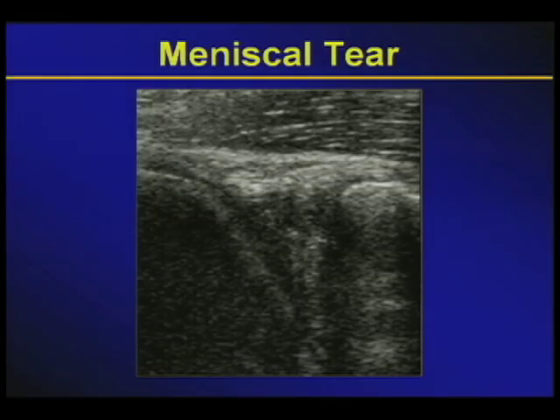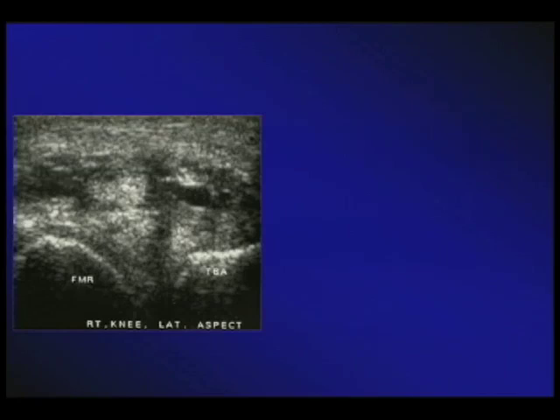Remember that the definition in a short axis view of the meniscus was a homogeneous triangle. Here you see that there are hypoechoic fissures cutting right across the entire swath of the meniscus in this case. Therefore, you could see clearly that what was an intrasubstance hypoechoic defect surfaces on the femoral level, clearly suggesting that this is a meniscal tear or at least marked intrasubstance degenerative changes of this structure.